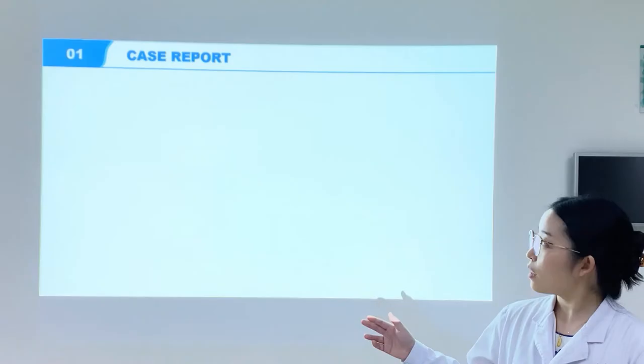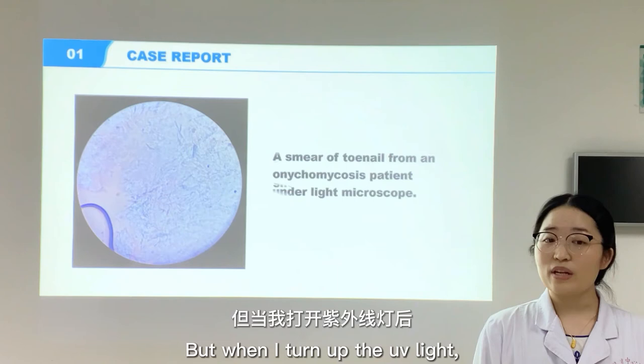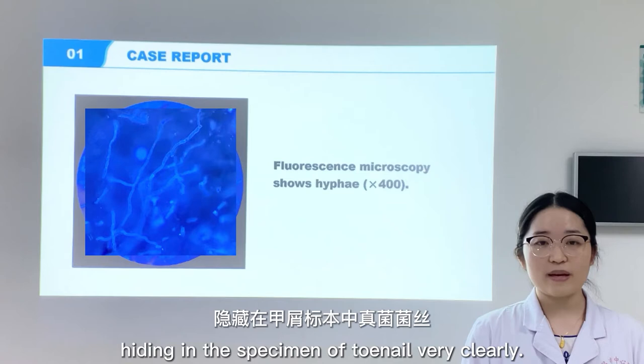This is the smear of toenail from an onychomycosis patient under the microscope. However, you could barely see anything related to fungus. But when I turn up the UV light, things become different — now we could see hyphae hiding in the specimen of toenail very clearly.